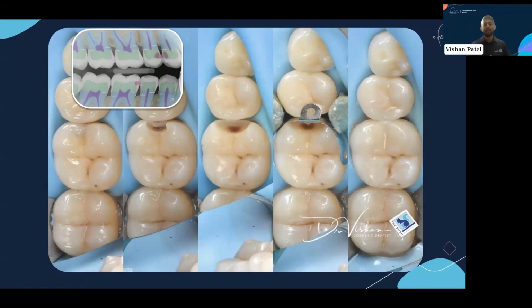So, I mean, I've got a little light which can help me as well. And I've also got a Diagnodent, so it can also basically test the density within a tooth. You literally just put it on the tooth and it will peep and it will give you a scoring. And if it finds there's a little area there, it will just peep a little louder, basically. So I use that as well. That alongside just looking at it clinically, you could just see a little shadow there. I then went with Pearl and my own knowledge to go ahead and do the filling, really. Thank you.